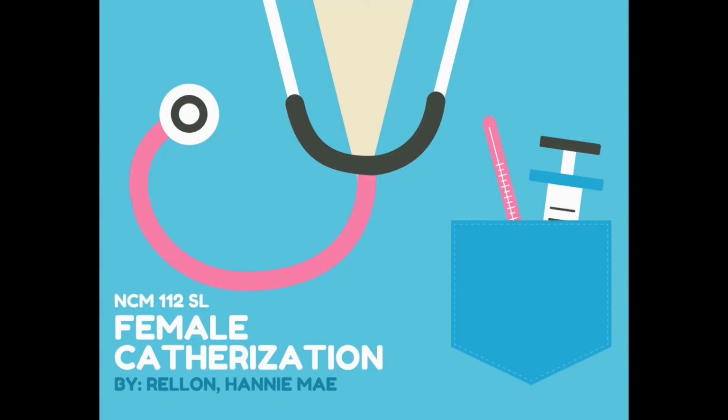So now I'm going to document everything, and I will also continue to monitor the patient until the catheterization time is finished. So, that's all. Thank you. So now I'm going to check the doctor's order.